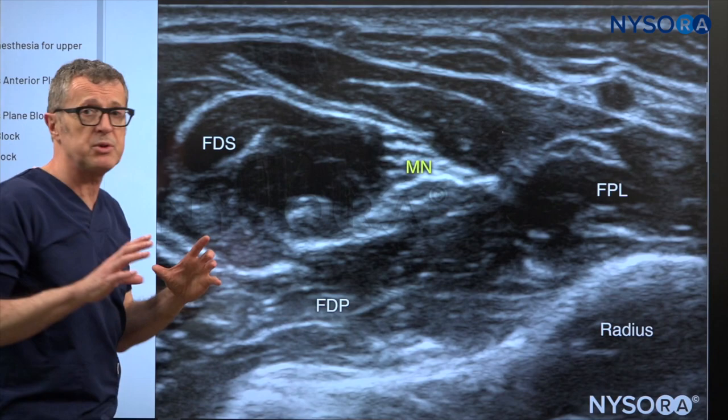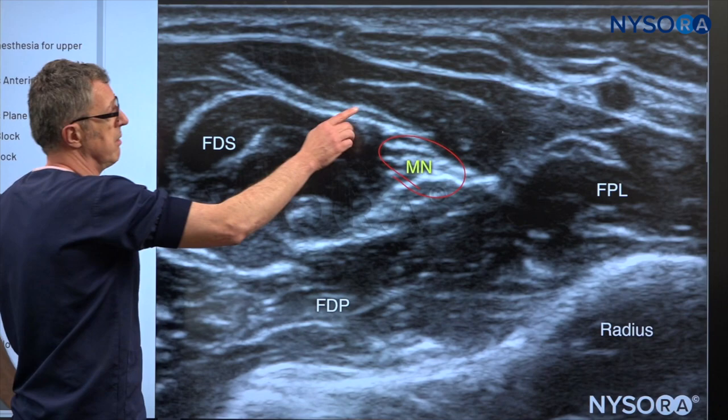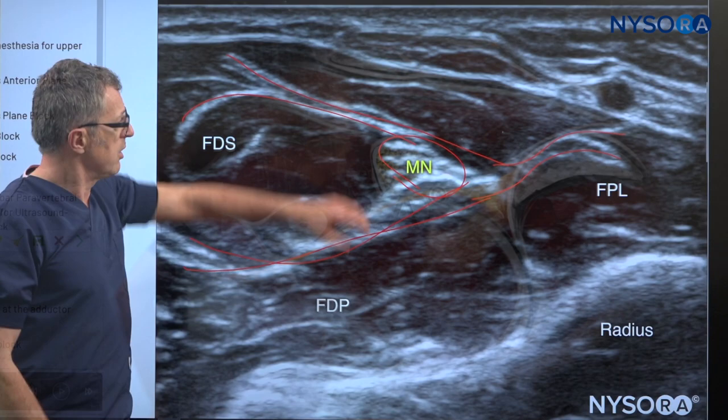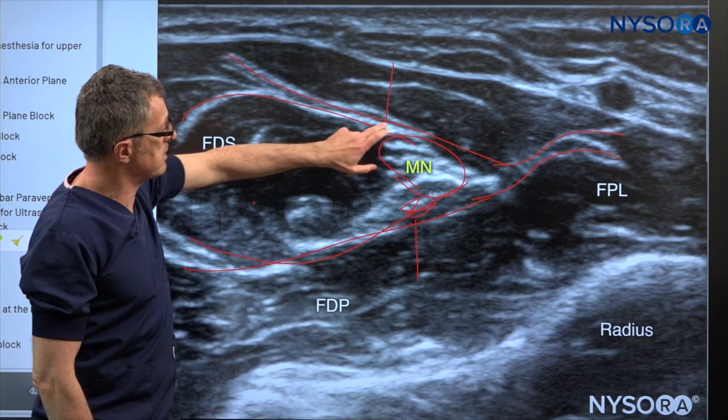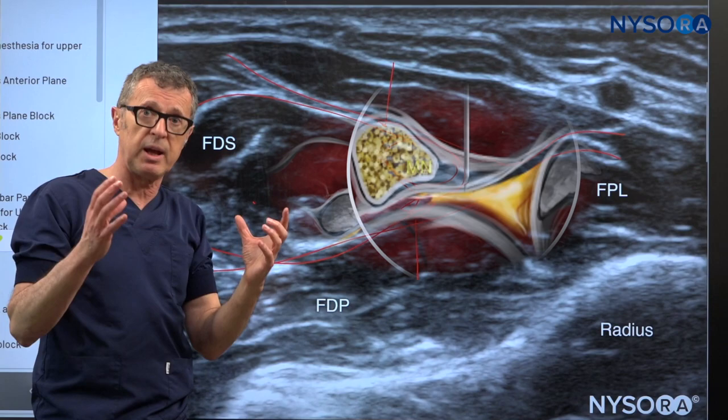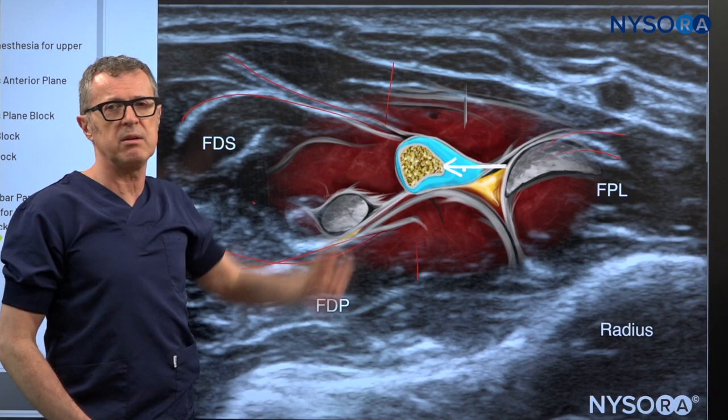Now I'd like to demonstrate the principle behind these blocks. That's the median nerve, and these are the fascia layers of the muscles above and below. We need to recognize these sheets so we can insert the needle in between the sheets of the superficial and deep flexors of the digits — that's where the injection occurs. It does not occur around the median nerve itself, but in the fascial plane that contains the nerve.